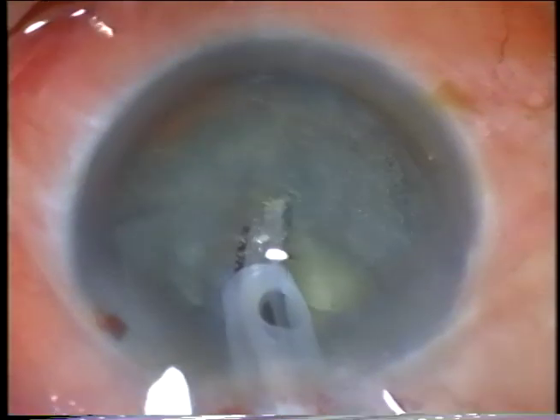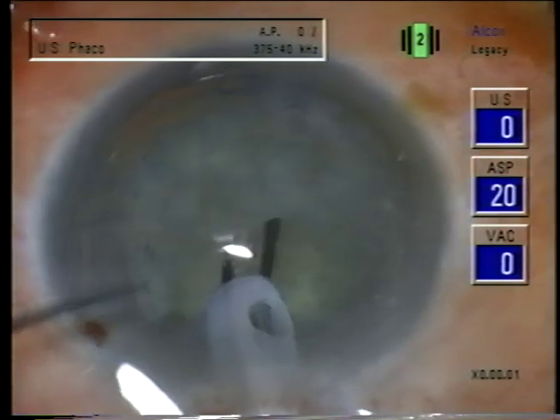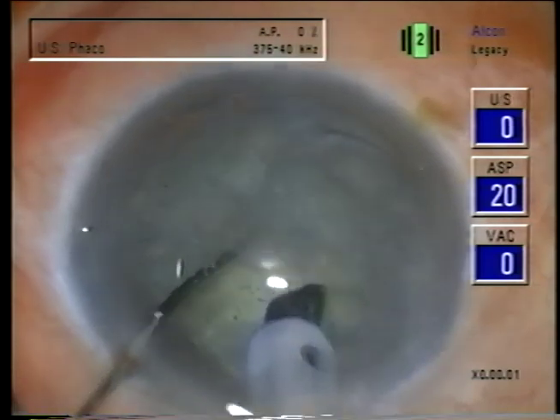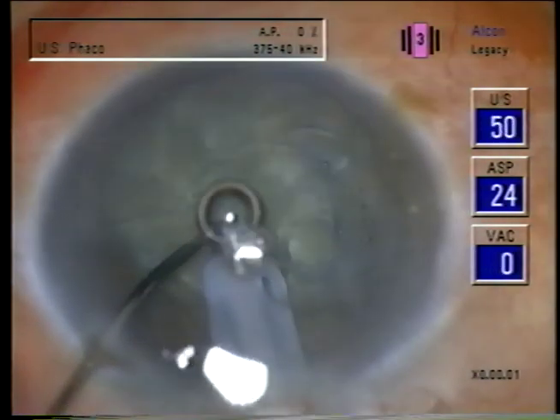I use suction before putting on any ultrasound to make sure that there's enough irrigation to cool the tip and cool the sleeve, and then start the emulsification.